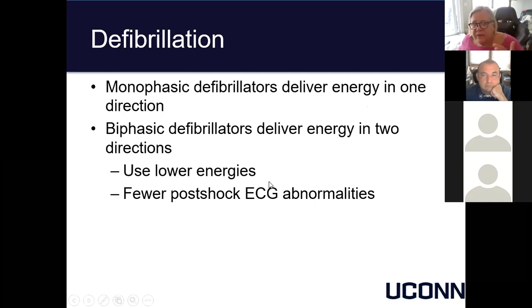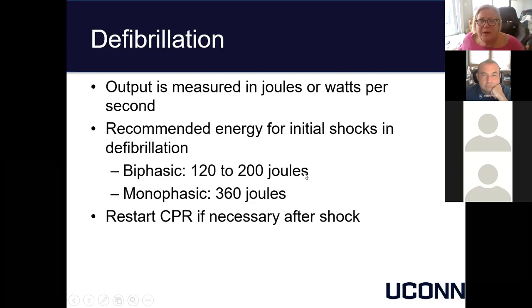We try very hard to use the lowest possible because you can definitely get burns on your skin. And I'll tell you, the gel doesn't always go to the edges. When they peel the pad off, you have a nice little imprint where the electricity got your skin and there wasn't any gel protection. It feels like a bad sunburn. Not the worst thing, of course, but just yet another pain.